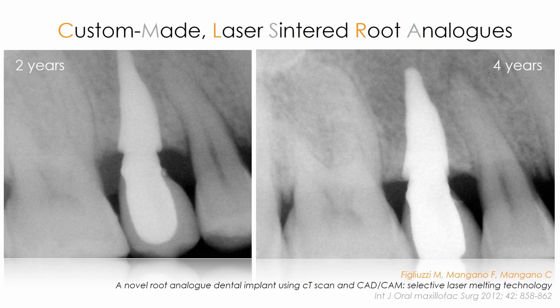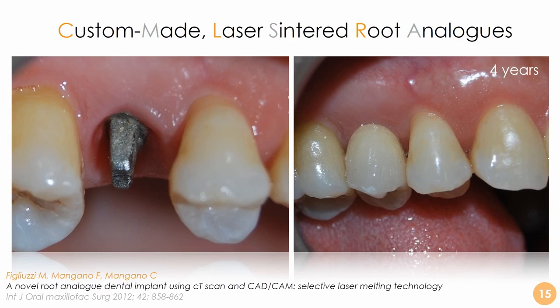Here we have the follow-up after 2 years and after 4 years, and look how natural looking it is. Look how the level of bone is maintained over the platform switching. The design of the implant was perfect. In this case the restoration was perfect, and everything is working very well. And Professor Figliuzzi is going to publish the 7 or 8 or 9 year follow-up very soon of this case. Here once again 4 years after, look at the perfect soft tissue integration, look at the aesthetic integration of the implant, everything worked very well.